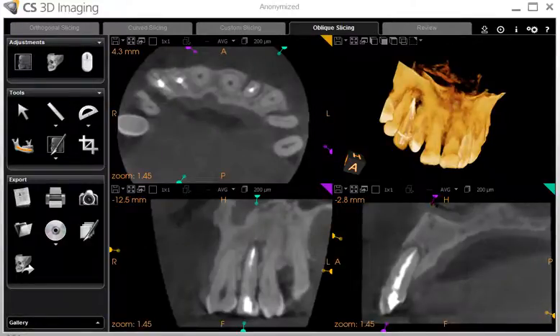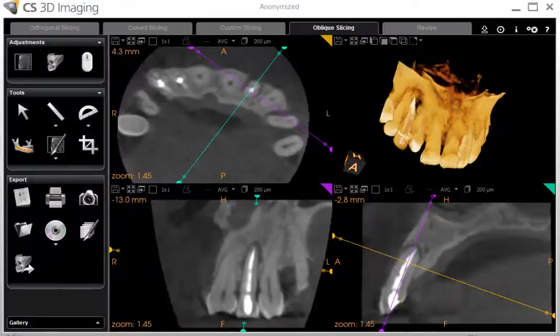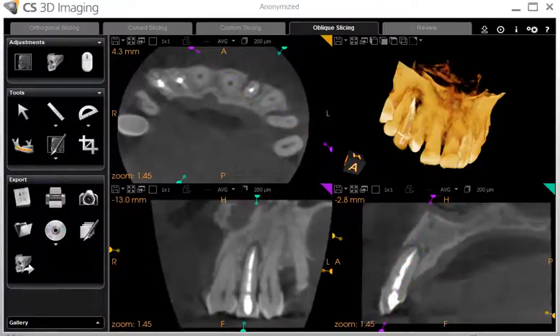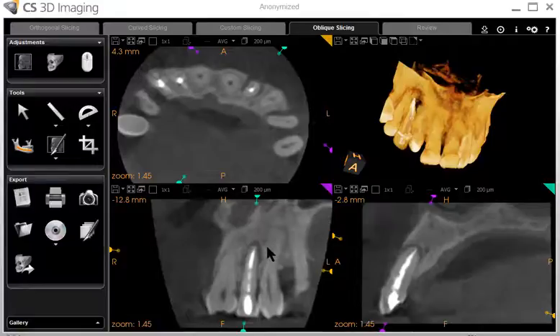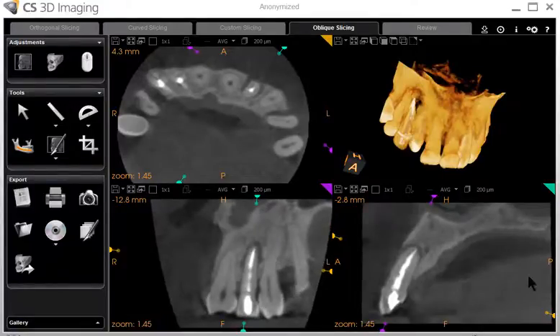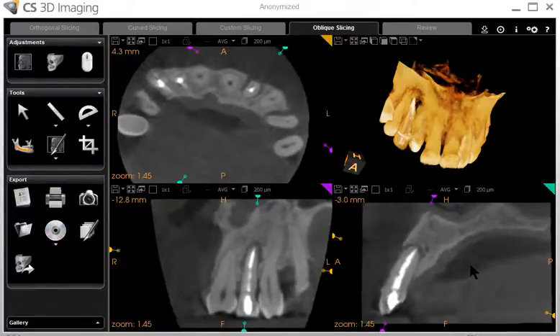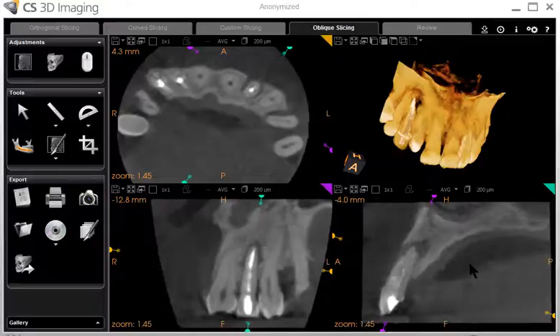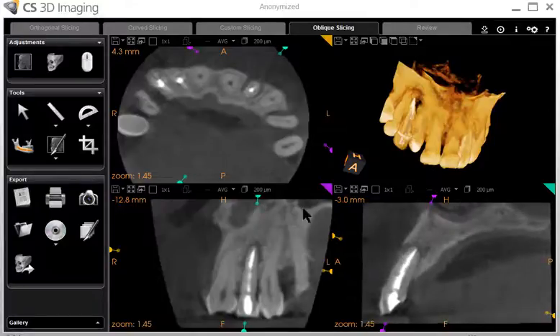And in the same way here, we focus in on an individual tooth and you can zoom through each slice to see where the bone loss has occurred.